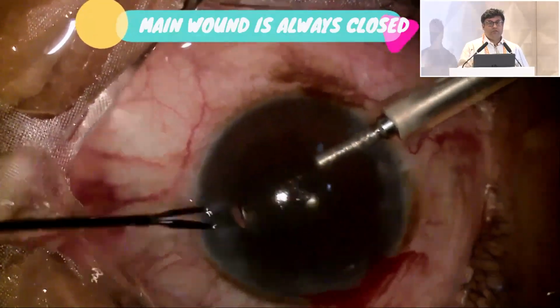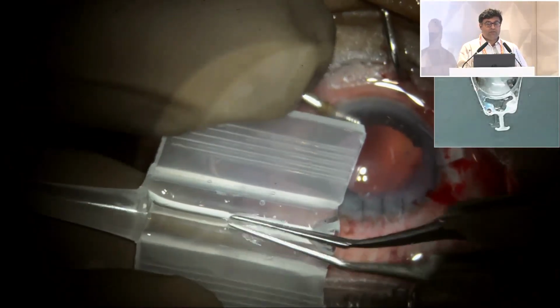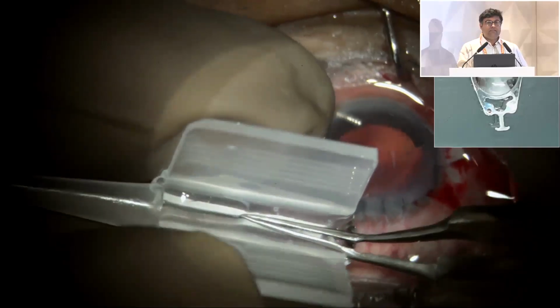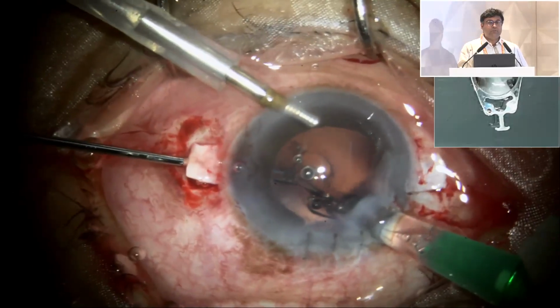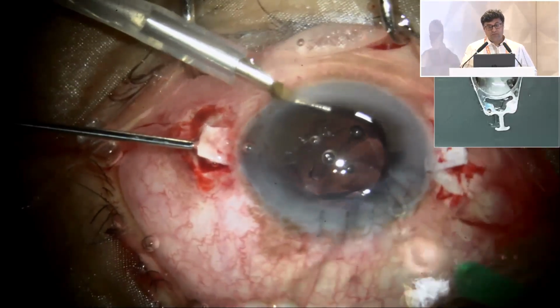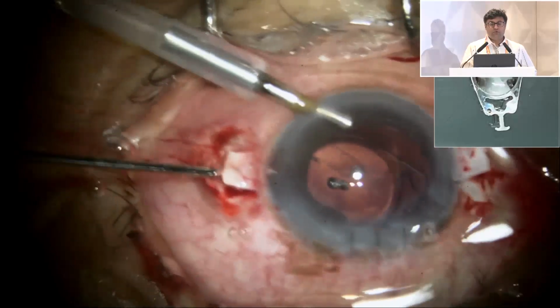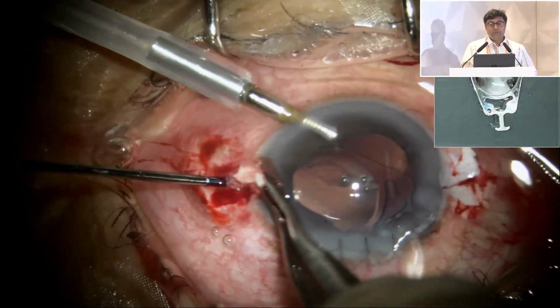So this is another way of probably retrofixating an iris claw lens. This is a very handy lens which is manufactured here by Appasamy in cases when you have surgical aphakia and the iris support is not good to put an iris claw lens. There's a type of scleral fixated lens where you do not really need to use a suture. You use a foldable lens, you put it into the anterior vitreous, bring the haptic out.